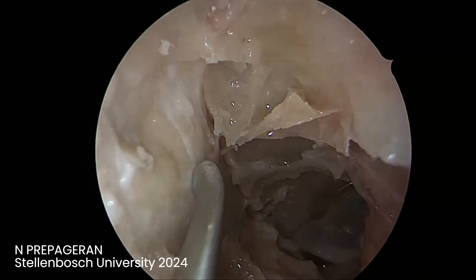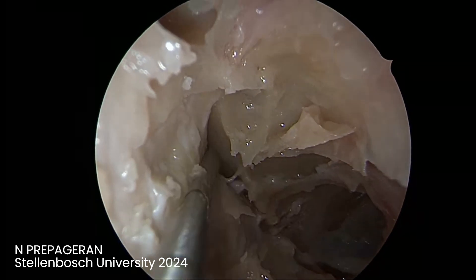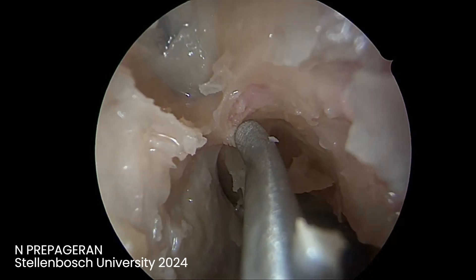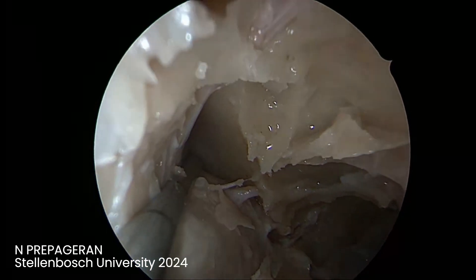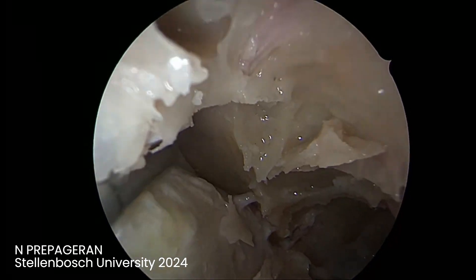We're going to do a trans-orbital approach medially. That's the anterior ethmoid artery coming across here, and that's the posterior ethmoid artery. Look at how both the anterior ethmoid artery and the posterior ethmoid artery get stretched if I do this.